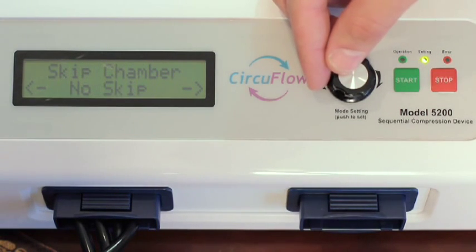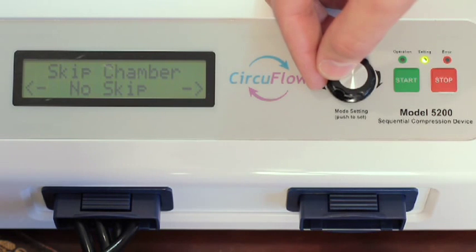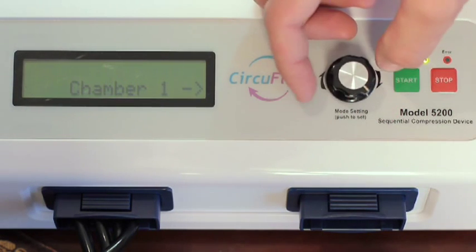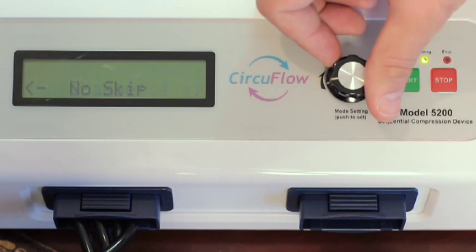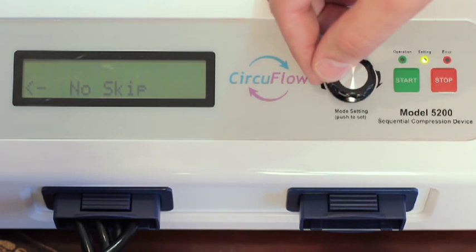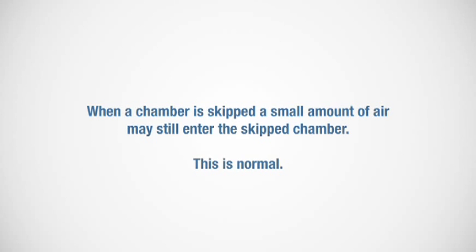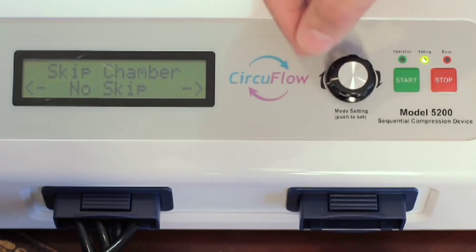To skip pressure in a chamber, turn the shuttle knob to the right until you reach skip chamber and press the shuttle knob to select. Select the chamber you wish to skip by turning the shuttle knob to the left or right. You can select chambers 1 through 4 or a fifth option, no skip. You can only skip one chamber during treatment. Note that when a chamber is selected to be skipped, a small amount of air may still enter. This is normal. Press the shuttle knob to confirm the skipped chamber.